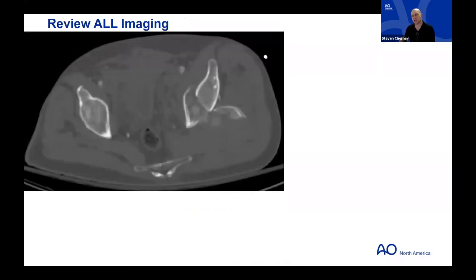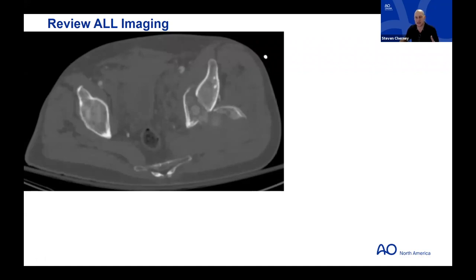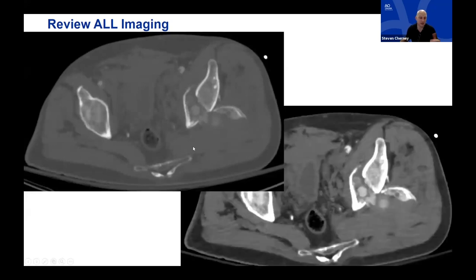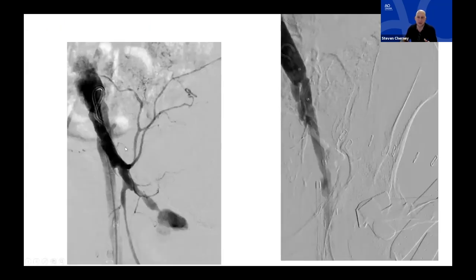But on soft tissue windowing with contrast, that circular structure in the middle is clearly a pseudoaneurysm of the superior gluteal artery — roughly bigger than your pinky. When taken to the OR, the patient bled massively and had to go emergently to the angio suite, was packed, and came back on another day. This case is the reason to look at all windows on every patient.